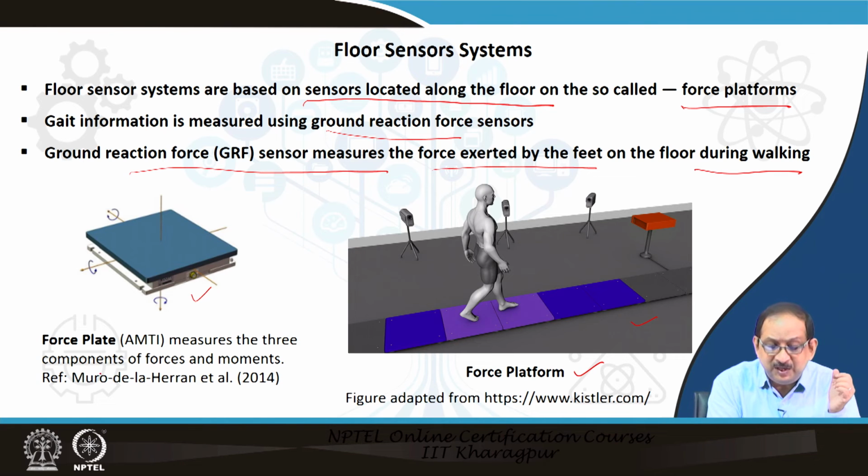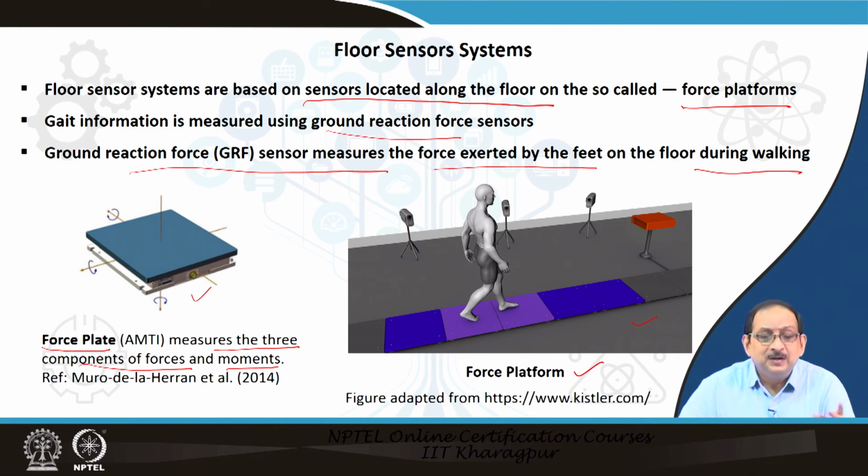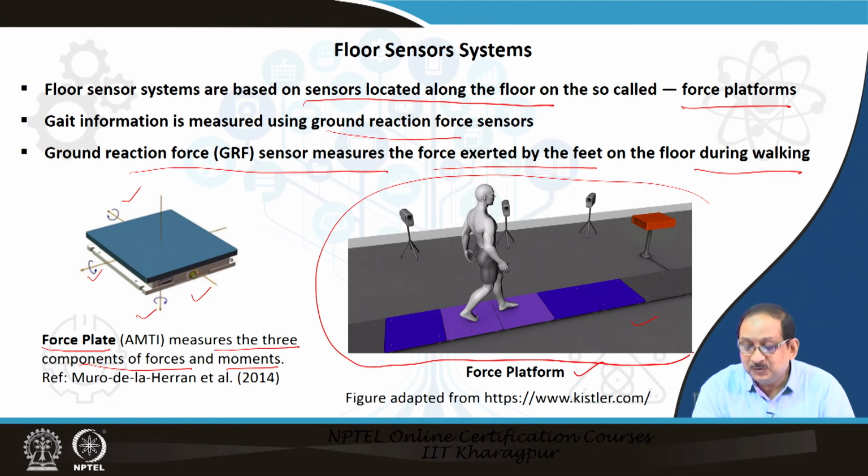On the left we can see a force plate which measures 3 components of forces and moments along the axes or directions x, y, z. These are the moments, and you can also get the forces. And this is a setup of a force platform.